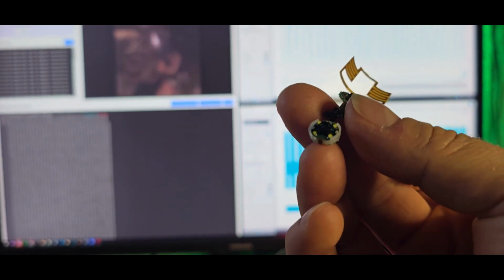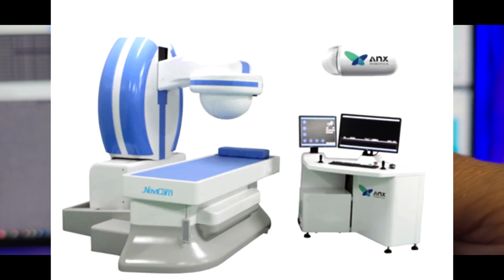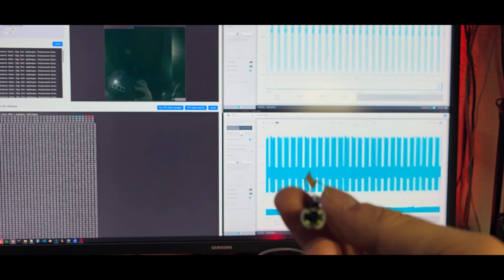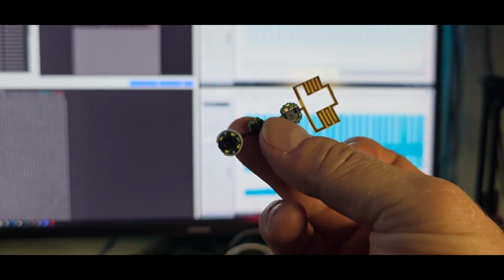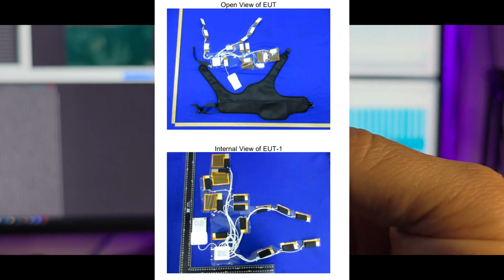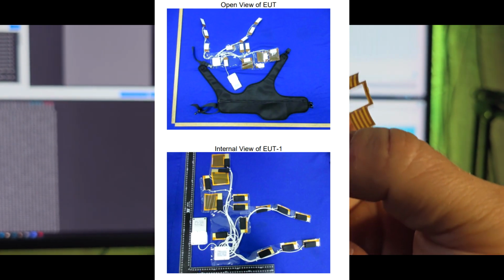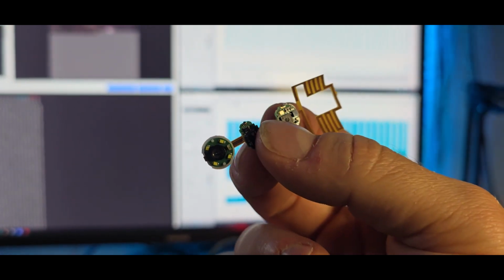I also found out that this camera is made by the company called Ankon, and as shown in my last video, this big magnet inside is really for a super big machine that they use from the outside to control the pill in your body in any direction they want. And yeah, quite impressive what they have done there, and that they just use this as a very universal camera to, for once, just give it to patients. In a normal situation, you will get a belt you put on, and in this belt there are somewhat like 10 receivers, and that way they can also know where in your body the camera exactly is, because with triangulation from multiple antennas, you can just figure that out as well.